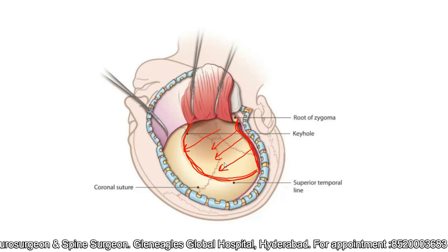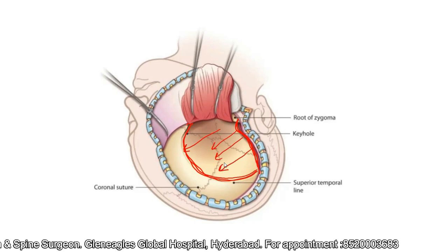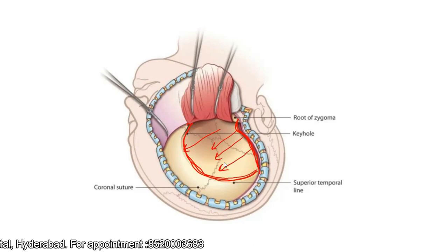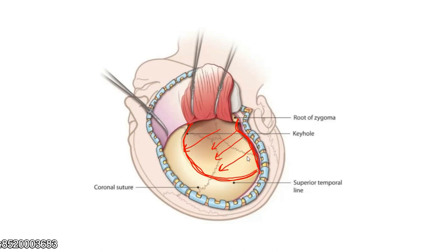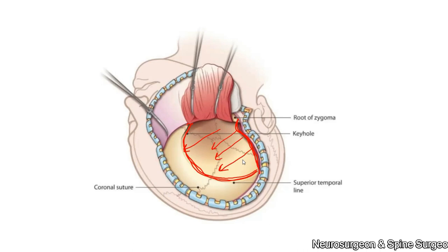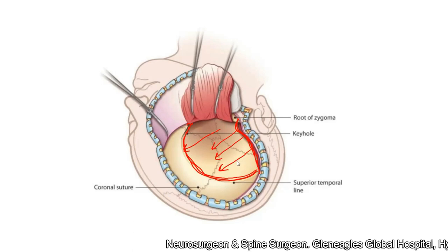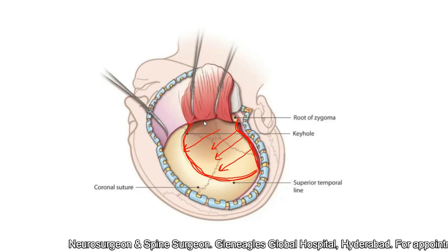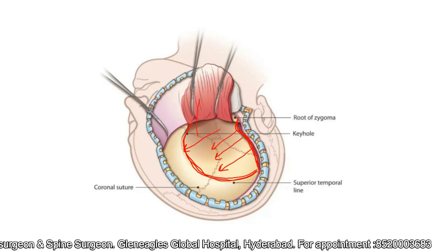If you are planning to replace the bone flap, you would leave that cuff for suturing. But because this is a decompressive craniectomy and you are not planning to preserve the bone flap, that precaution is not required. Now the temporalis muscle is reflected backward.